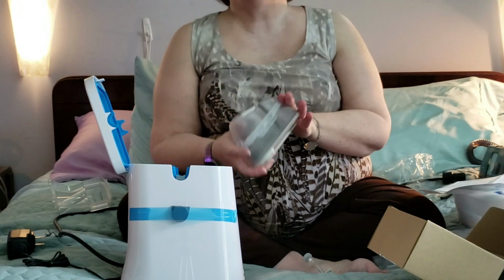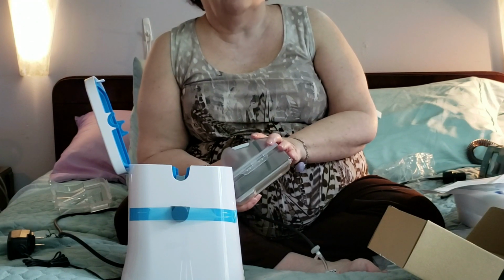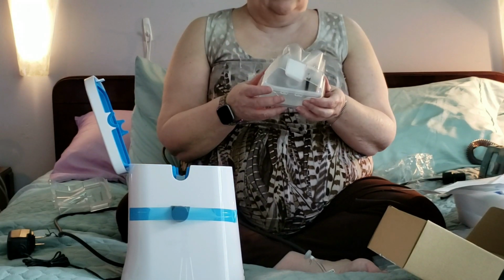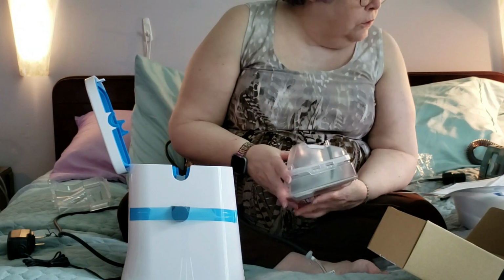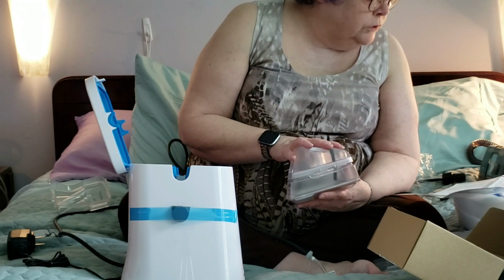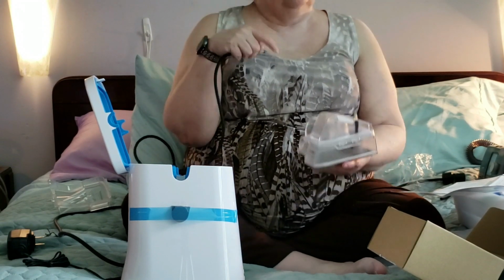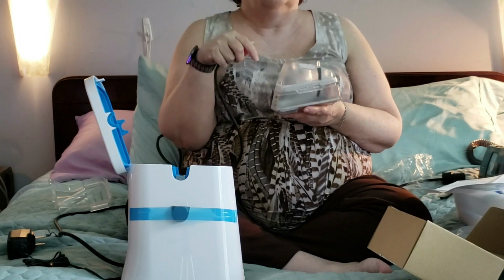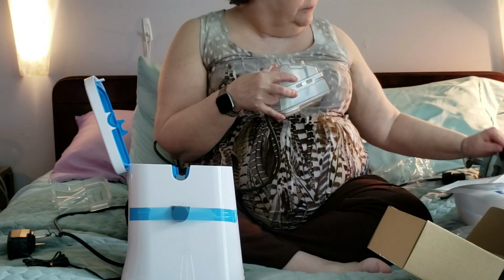So that's the other thing, they have to get the schematics and everything from the PAP machine makers so that they can create a correct adapter. So that's pretty cool. So now, fill the reservoir, close the new lid, and insert the reservoir into your CPAP. Connect the SoClean tube. I'm not going to fill this right now because I'm going to be doing one last video in this series that will be on how I've liked using the new CPAP.